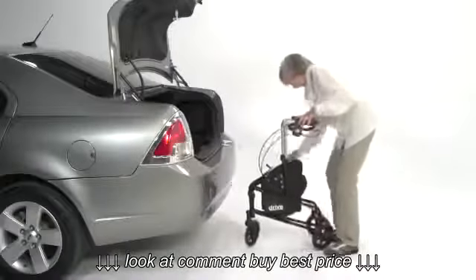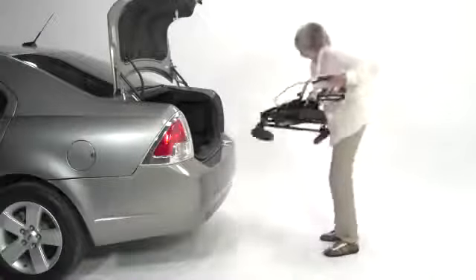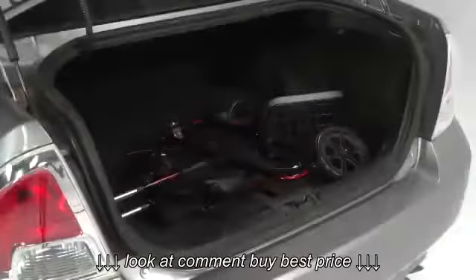The lightweight compact frame folds in two directions, so it's easy to lift in and out of a vehicle, or store when not needed.